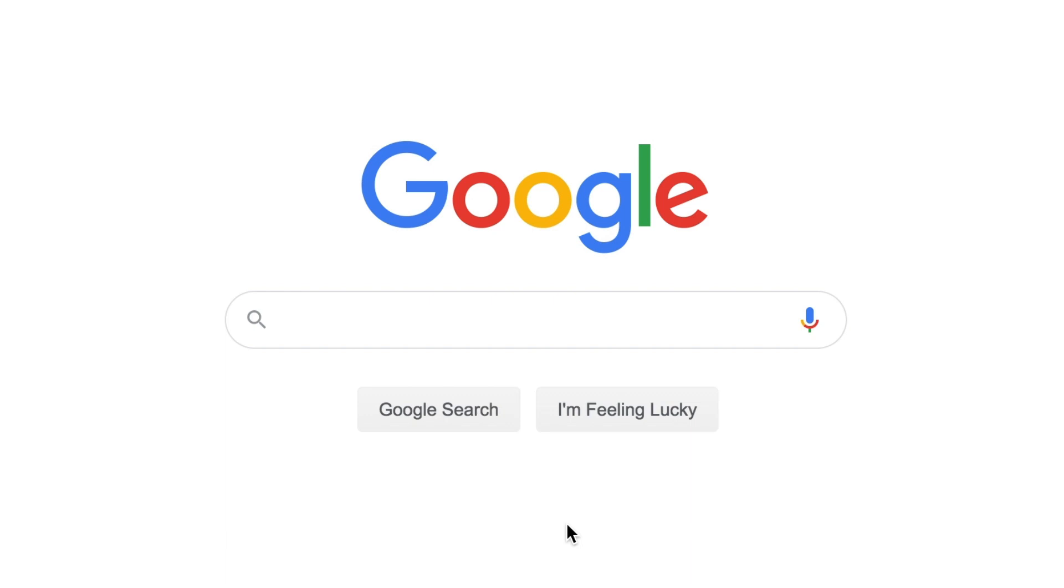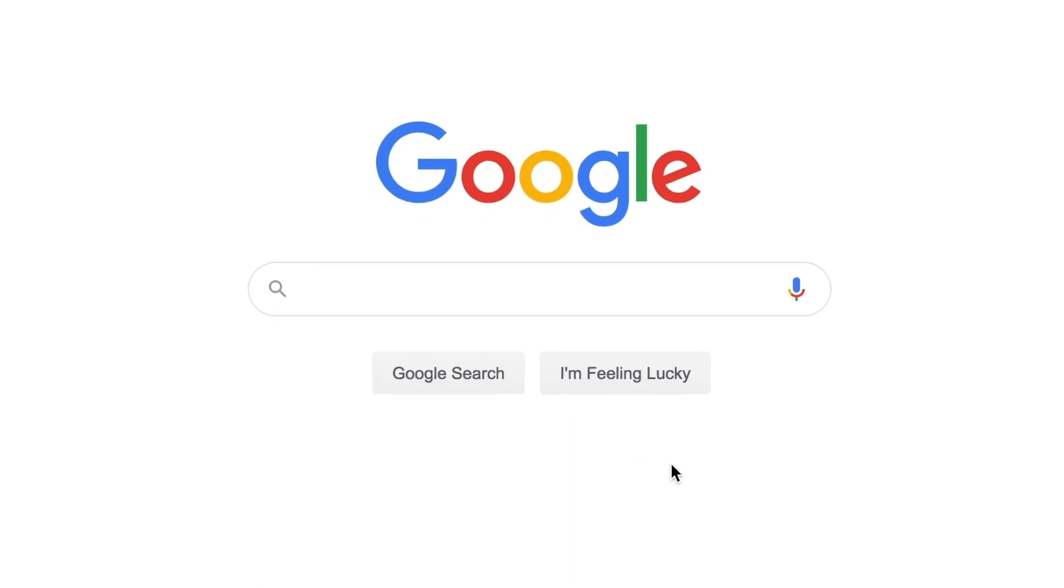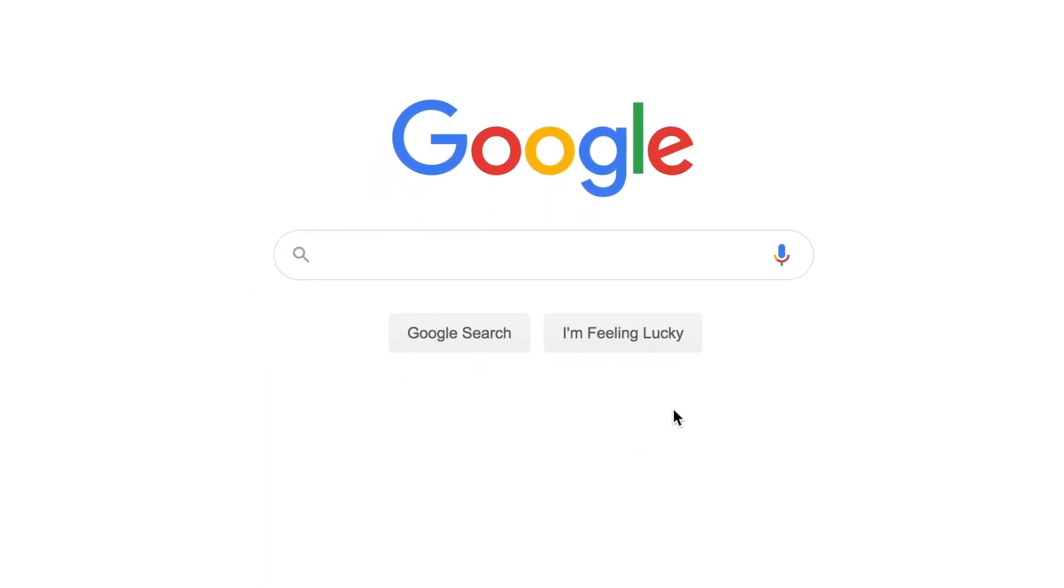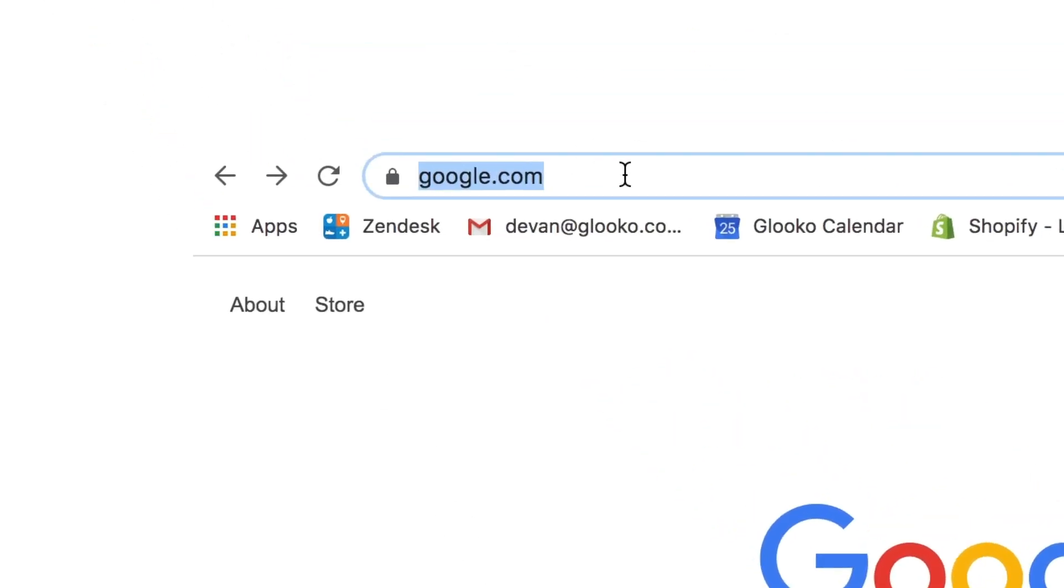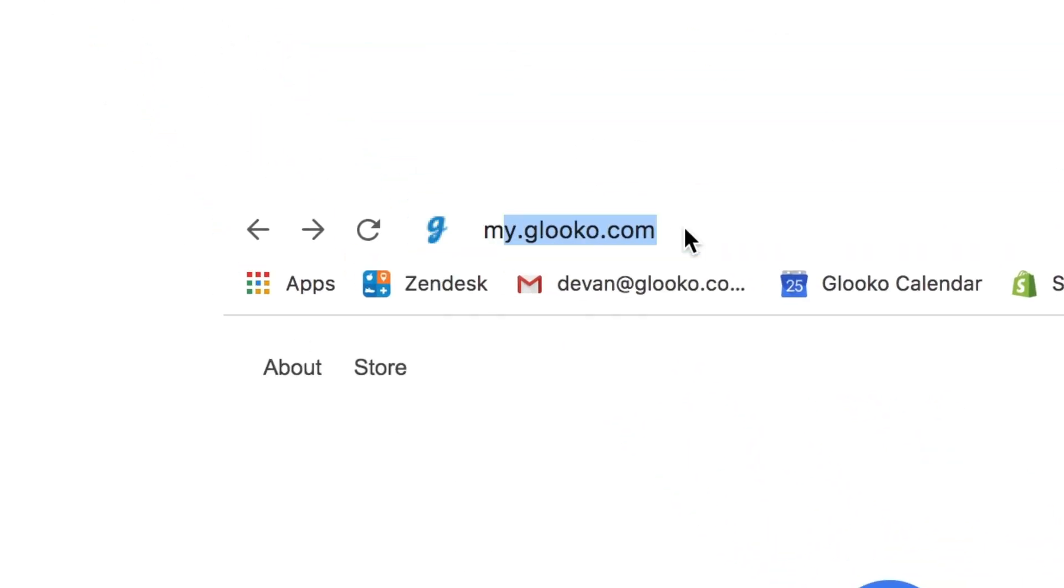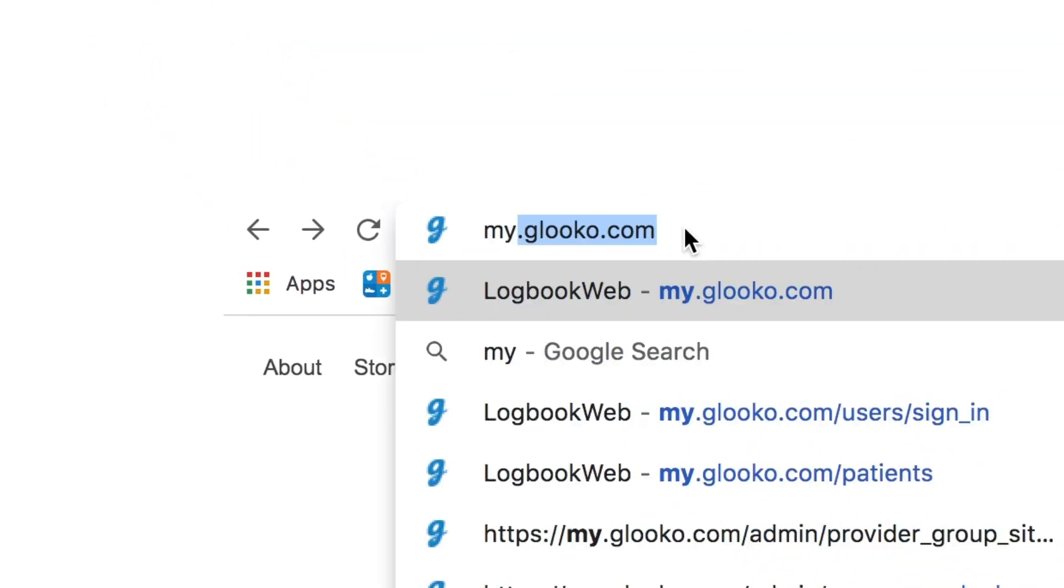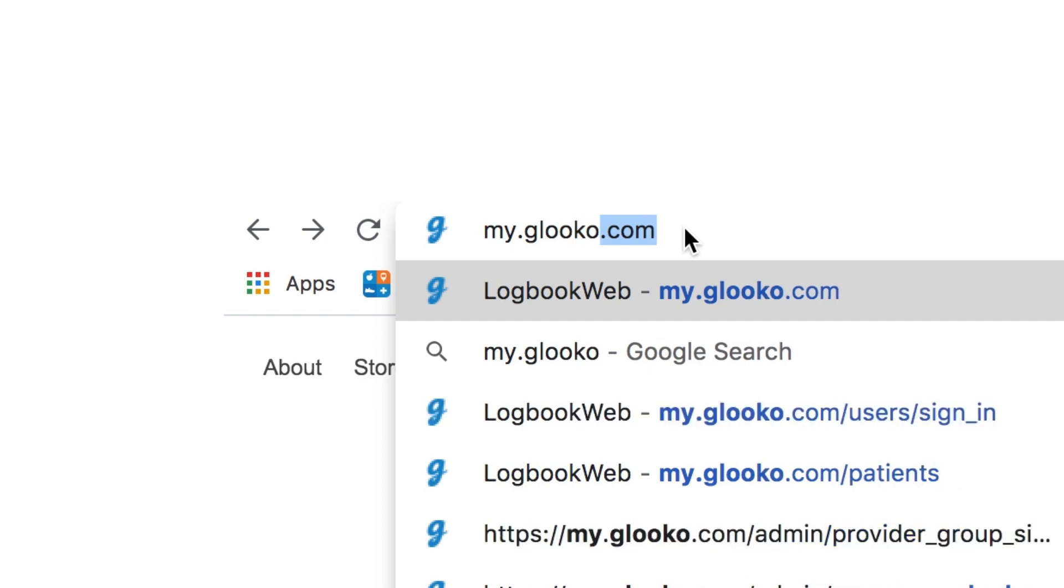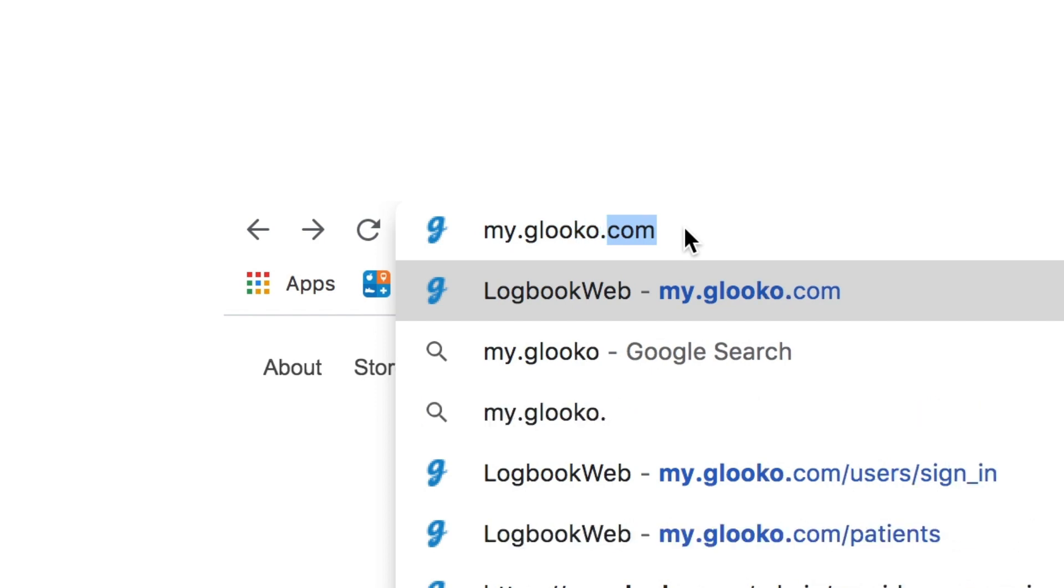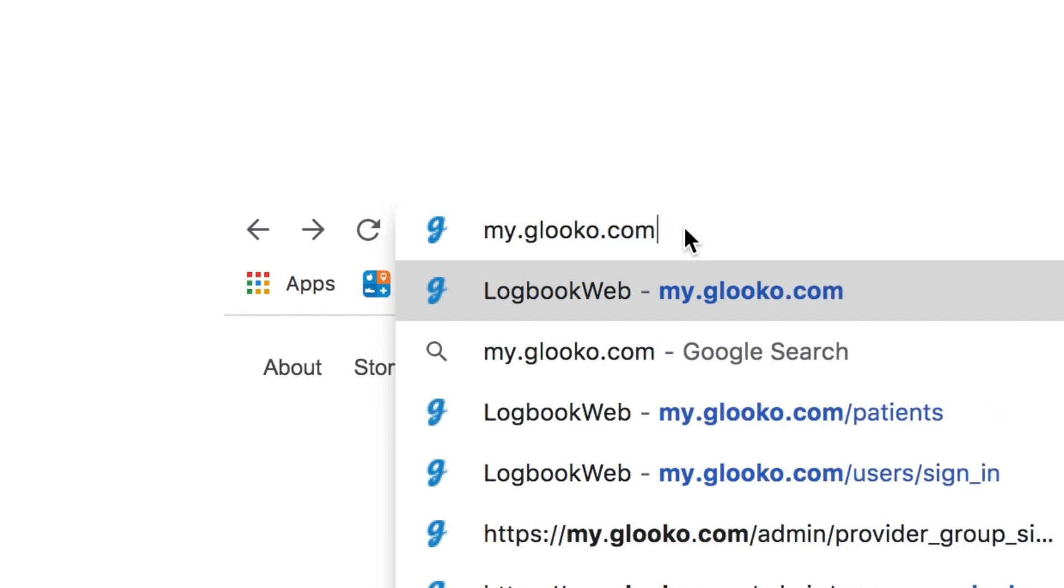First things first, we'll need to navigate to the sign-in page. So I have a modern web browser open here. For my purposes, I'm just using Google and we're going to go up to the address bar and we're going to type in my, M-Y, dot Glooko, G-L-O-O-K-O, dot com. Once you have that typed in, you'll want to hit the return key.